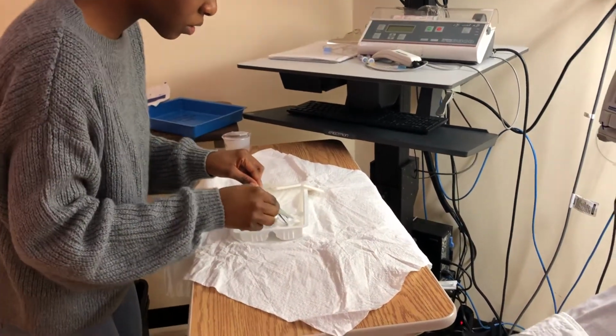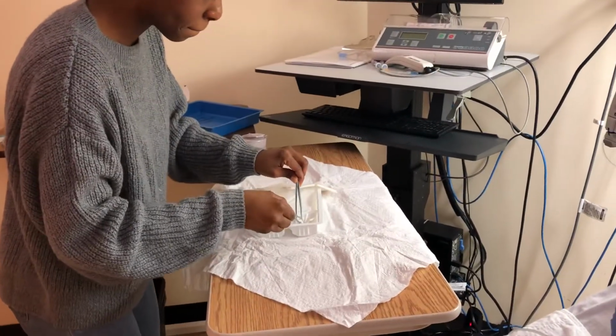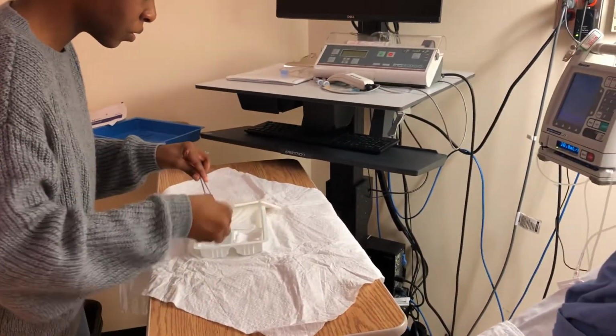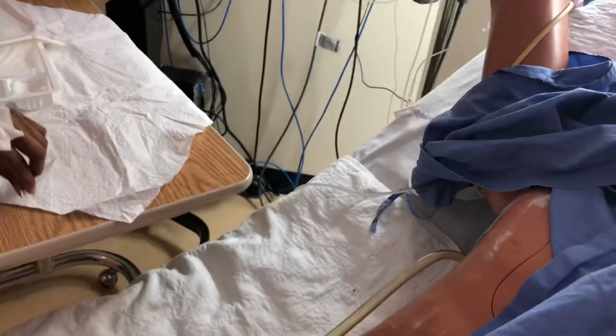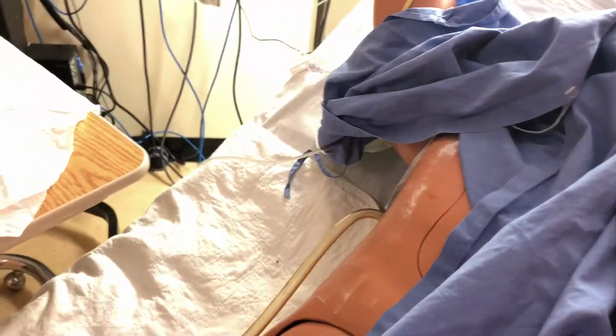So I'm gonna take this. Put this in normal saline. So one swipe around and it's dirty. So we throw this in garbage. 2x2s.